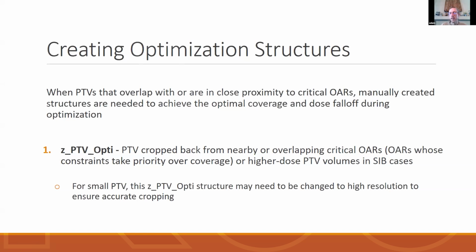And because we have these concepts of knowledge of dose fall off, the idea is to predict it. And we want to predict it in such a way that you can crop this PTV a certain distance away from OARs. And by doing this, if you know the minimum distance that you can crop, it makes for no conflicting arguments in your optimizer. So whatever optimizer you're using, if you don't have conflicting arguments, it works really well.